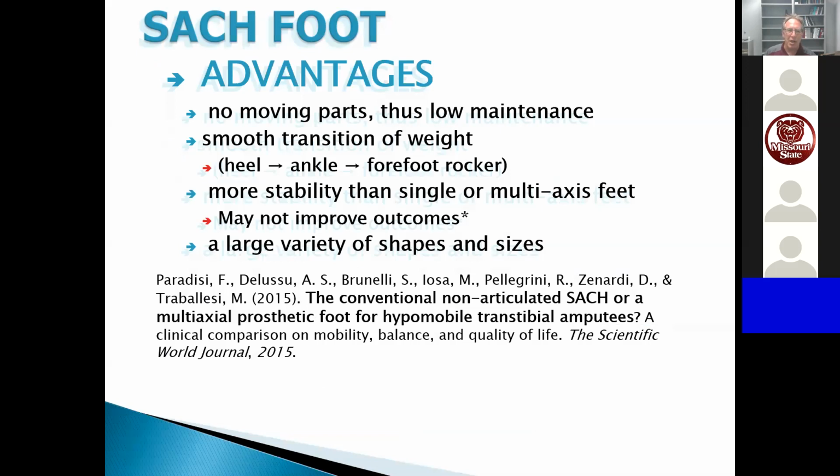So the articulated foot generally allows for plantar and dorsiflexion. Okay, and I want you to think about this for a minute. So take a minute, please, and tell me why you think that these patients actually had better walking, that is faster walking, and lower energy cost of walking with a foot that could plantar and dorsiflex. I'll give you a hint, the really important thing is the plantar flexion.